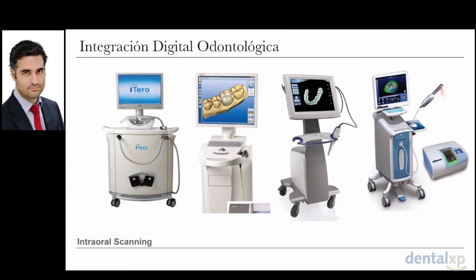Of course, we are talking about digital. As you could see, the only thing that was digital here was the customized abutment. That was a CAD/CAM abutment that I started working with more or less 4 years ago, and since then I'm working with this kind of abutments. I feel very comfortable. I'm very confident with them. But it was only the digital part that we could have in our treatments.